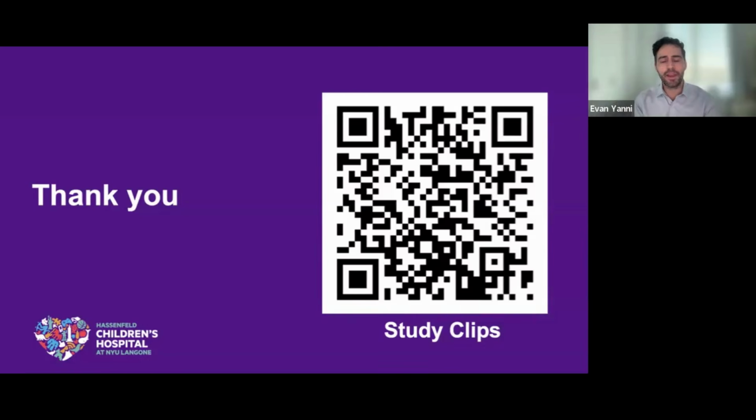So one of the biggest issues is just finding the clips. So clip acquisition. Cardiac arrest in children is fairly rare. And then actually having a point of care ultrasound clip of the arrest that was saved in the moment. And then on top of that, actually having a somewhat quality image. If you download this QR code, you can see that not all the clips are really created equally as well. So I think one of the issues too is just quality control for your clips and trying to assess your sense of quality control.